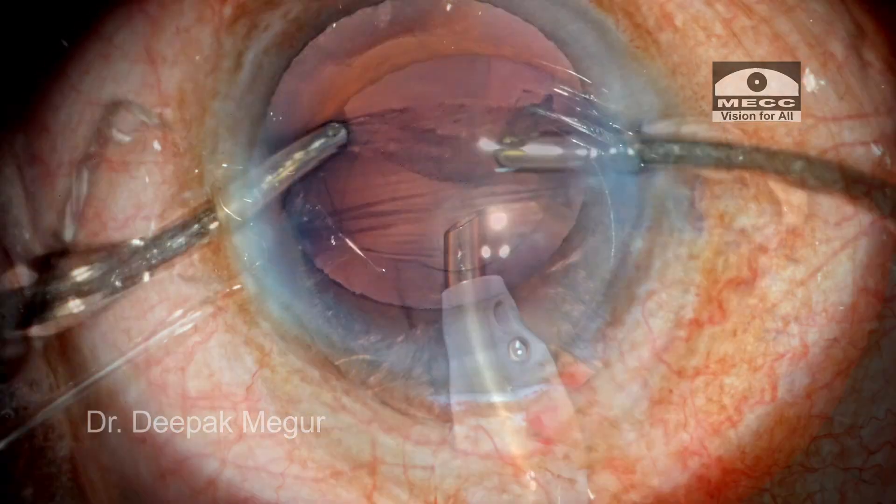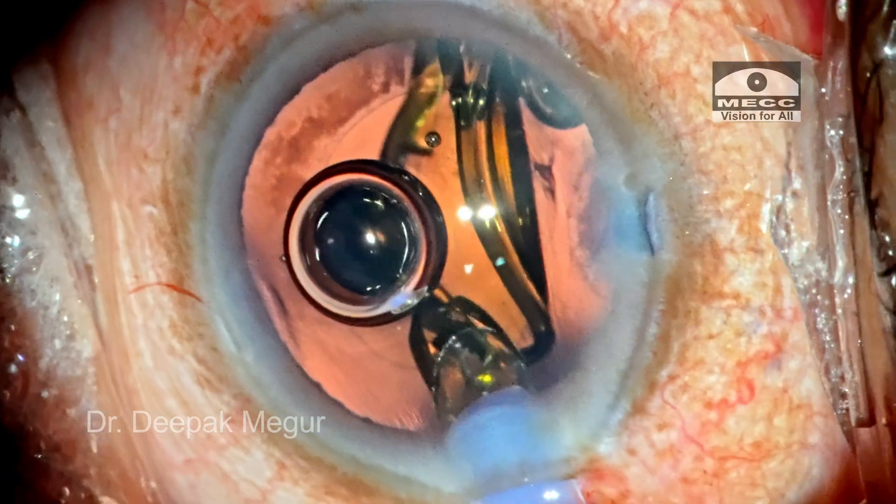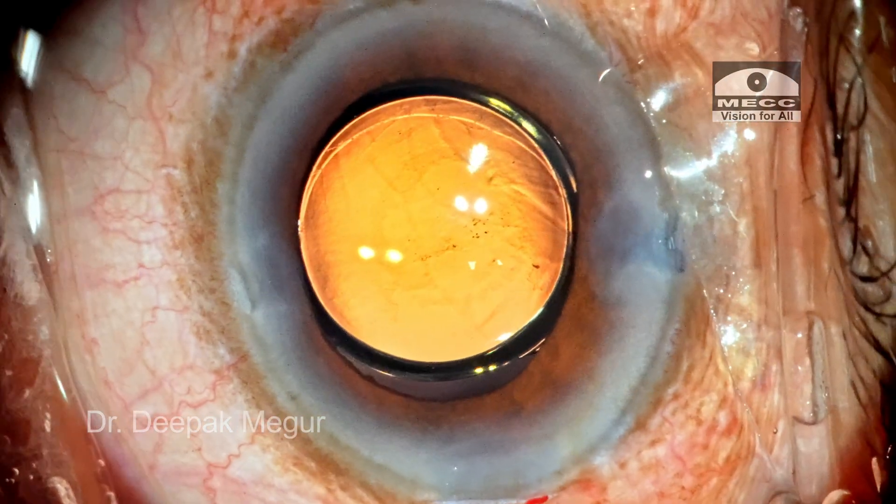Now is the time to remove the cortex. Manual irrigation and aspiration is done to remove the cortex. The lens is placed into the bag. That's it.